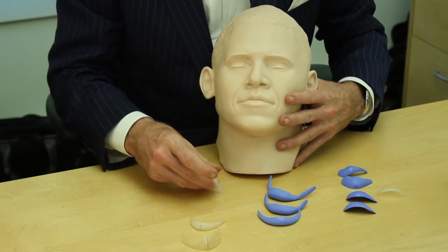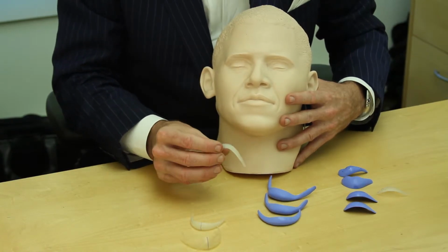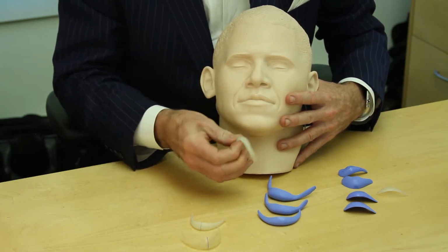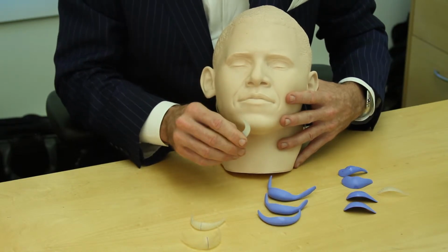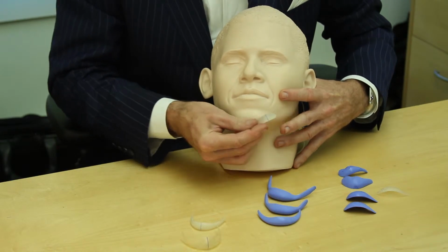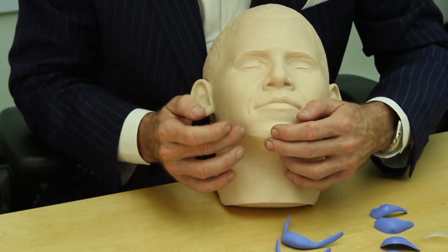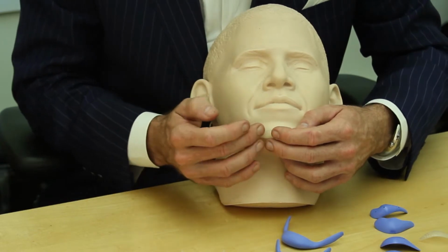Now these are actual implants here, ones that we would use. These are ones that have been explanted, washed, and sterilized. I don't use them again. They're used for me as models. But you can see that they're made of a very soft material. I can smash this, and it feels soft, softer than rubber. But the beauty is that they fill in the geniomandibular sulcus here in the corner, an area that we all lose soft tissue in. It's the end of the marionette line here.